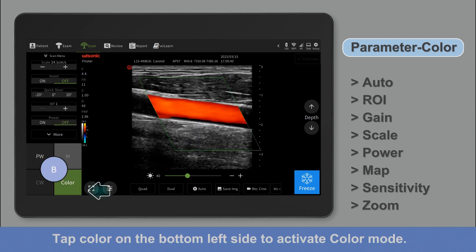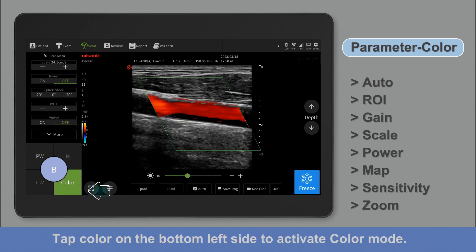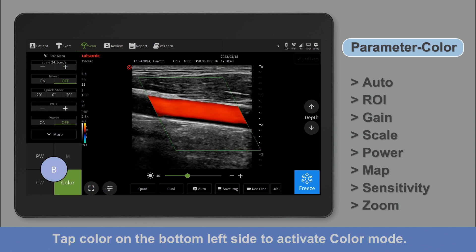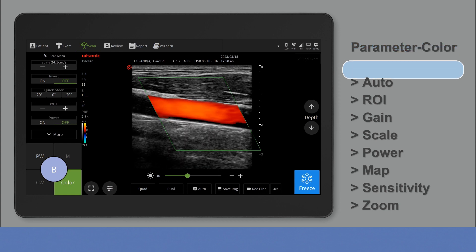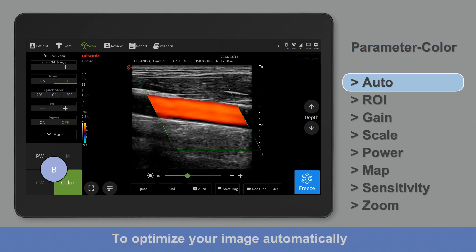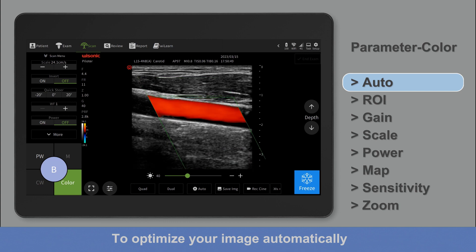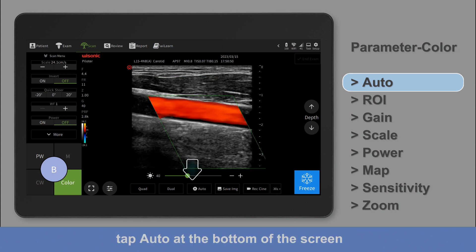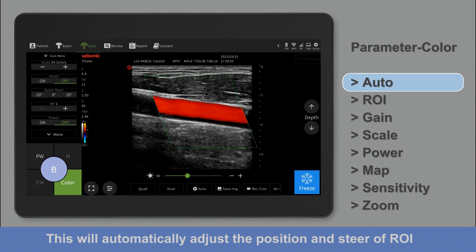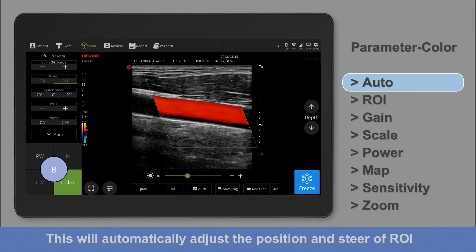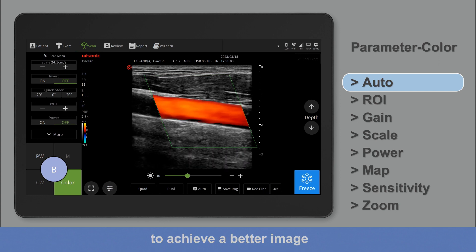Tap color on the bottom left side to activate color mode. To optimize your image automatically, tap Auto at the bottom of the screen. This will automatically adjust the position and scale of the region of interest to achieve a better image.